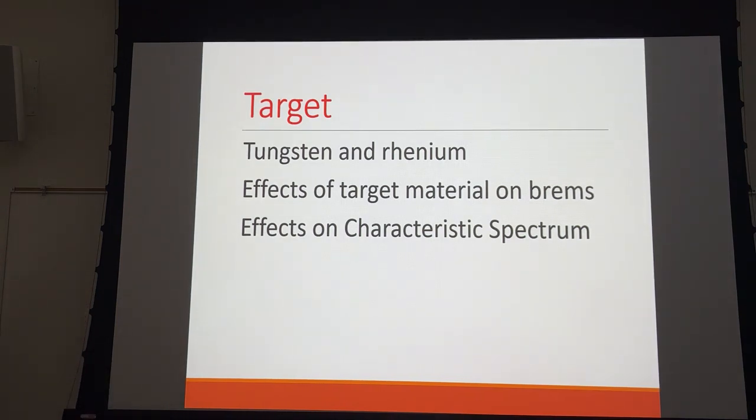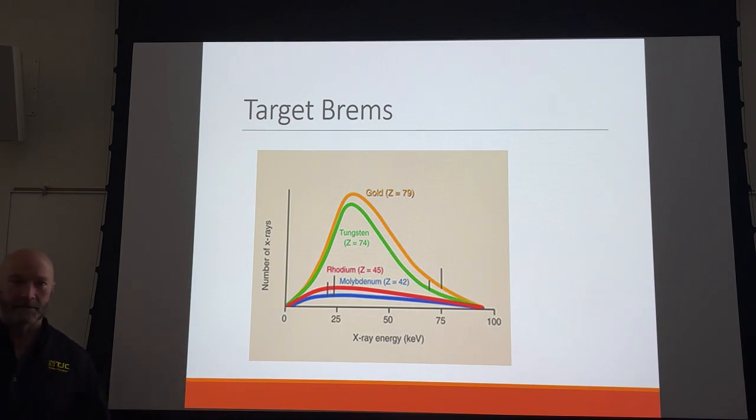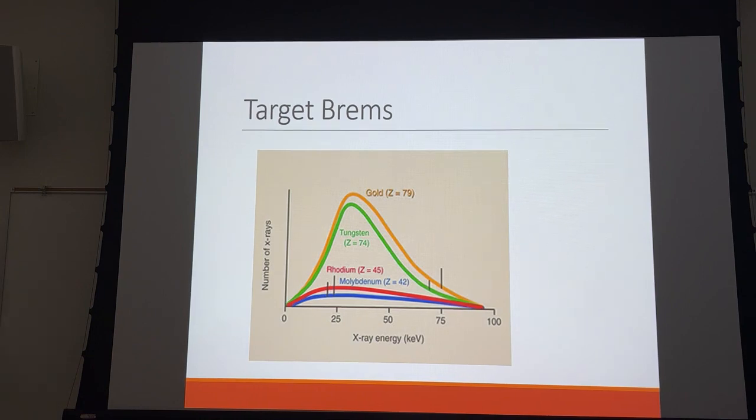So if you use fewer protons, then you're going to have less of a charge, and it's going to be more loosely bound. So for the brems spectrum, if we could increase the gold, that'd be great. But what's the hazard in changing the gold? It melts quite easy, right? And then you might have meth heads coming in stealing your x-ray tube because of gold. So you can't use gold. Tungsten is not too far behind it, but molybdenum and rhodium are way down here.